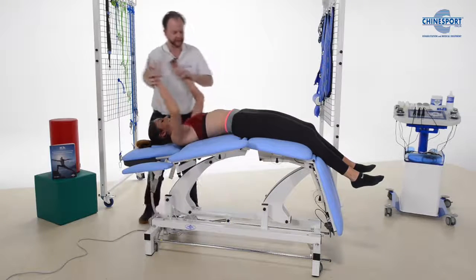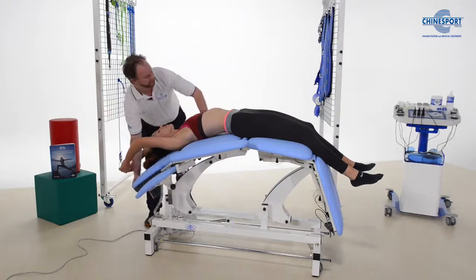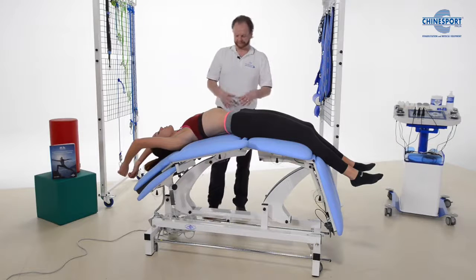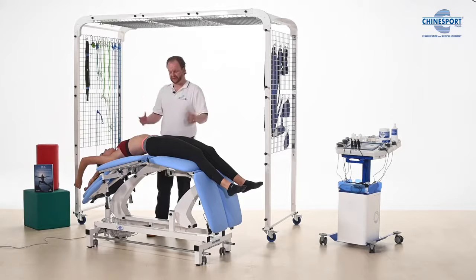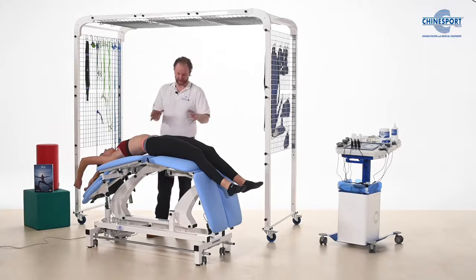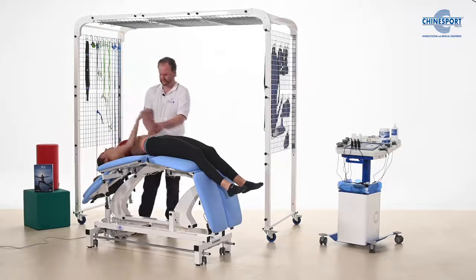You can lift up again, and we always check the breathing, check that there's enough abdominal breathing. For somebody who has back pain, often the sensation is very strange. People think that they are in this massive kind of yoga bridge pose, but as you can see, it's not, so it's very safe. You can come back.